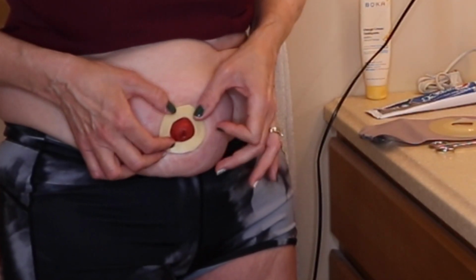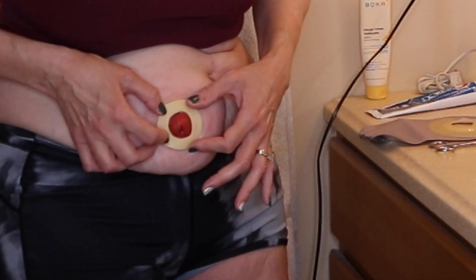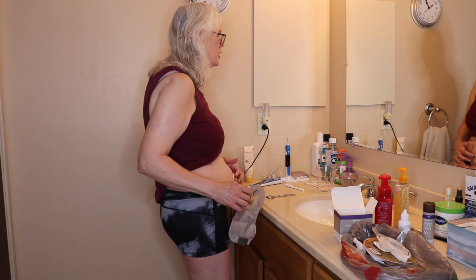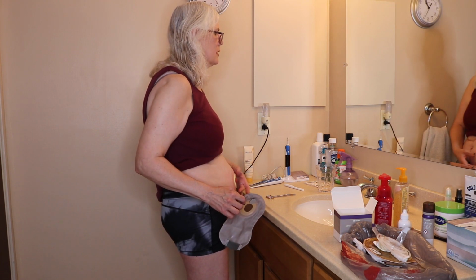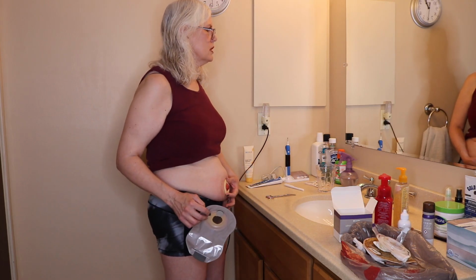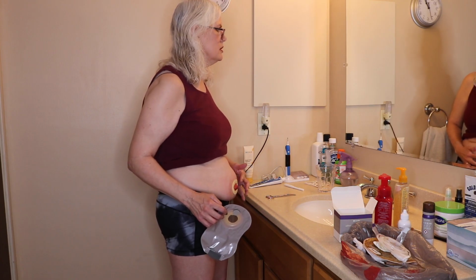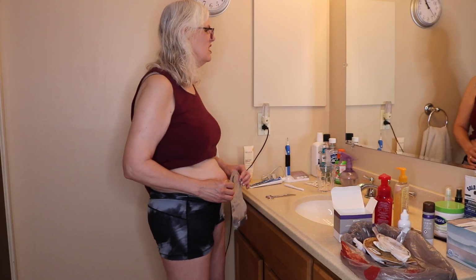The thing is too that when this gets wet from the output and stuff, it does expand a little bit. So just make sure I try to get it as covered as possible, because wherever there's an opening, when the feces does come out, if it gets on there, the acidity from the feces can harm the skin. That's what kind of eats away at the skin.